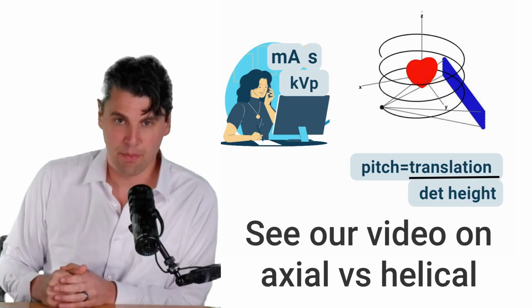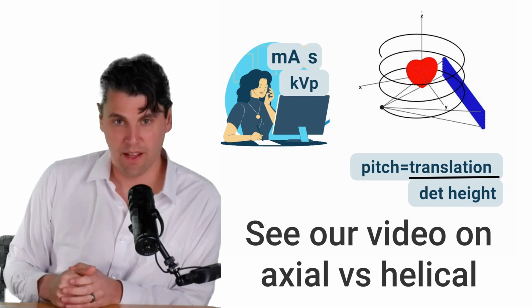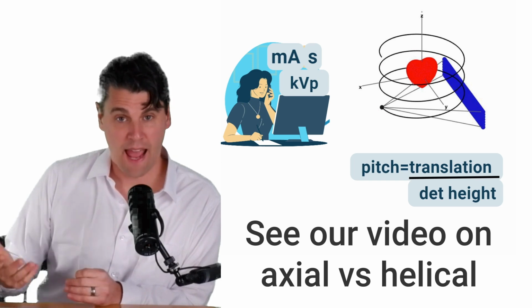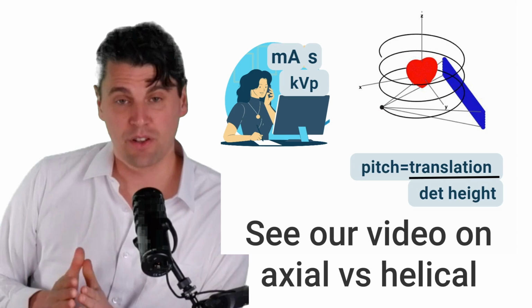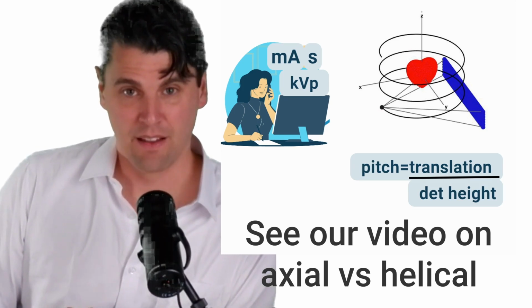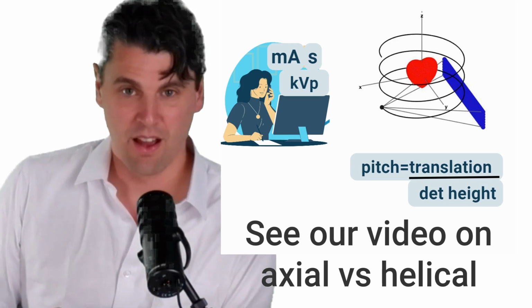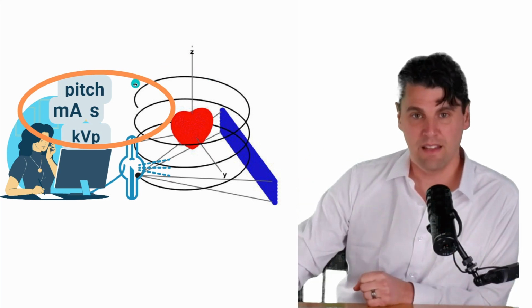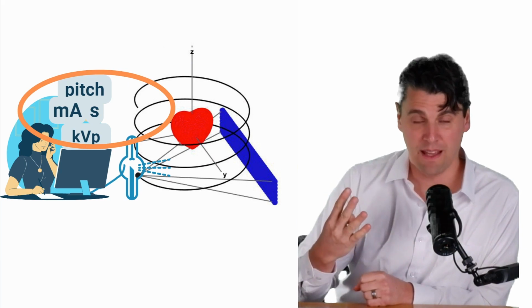So it's a relative number where a pitch of 1 is most comparable to an axial exam in terms of the sampling. With a pitch of 1/2, you have more duplicate sampling, and with a pitch greater than 1, you actually have less sampling. So in a lot of regions, it's more like a short scan rather than a full scan acquisition. So these are the factors that we're concerned with on CT: pitch, mA, time, and kVp.